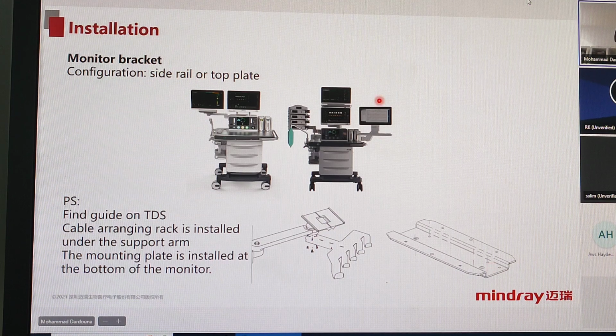Okay, this is the side rail configuration. You can find the part number of the side rail also in the part list, or we also have the GCX part number related to all the side rails supported by our unit. Usually we are dealing with the GCX for the arms of the monitor, for example, or the infusion pump.